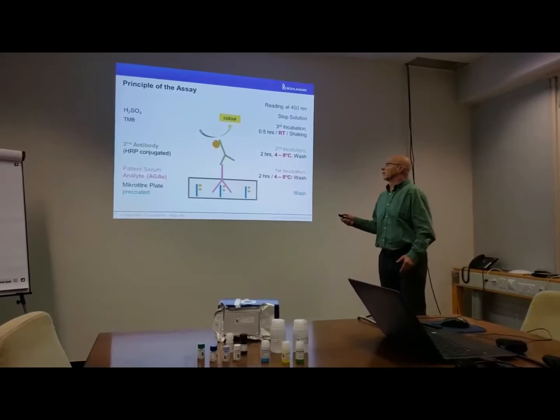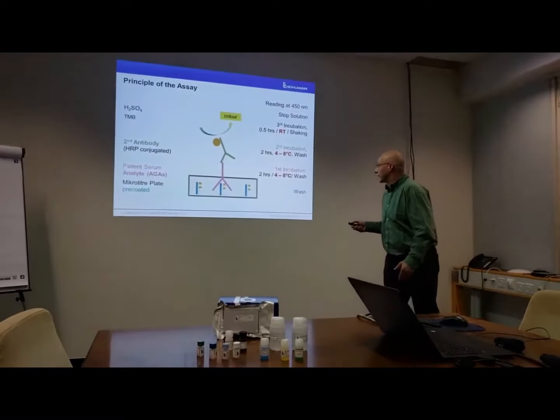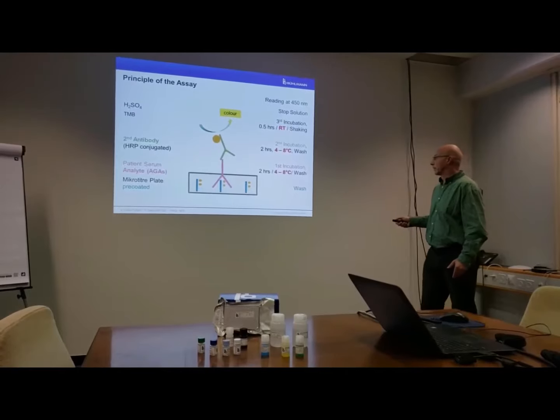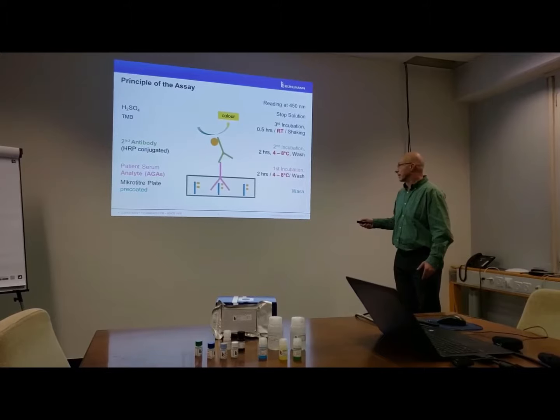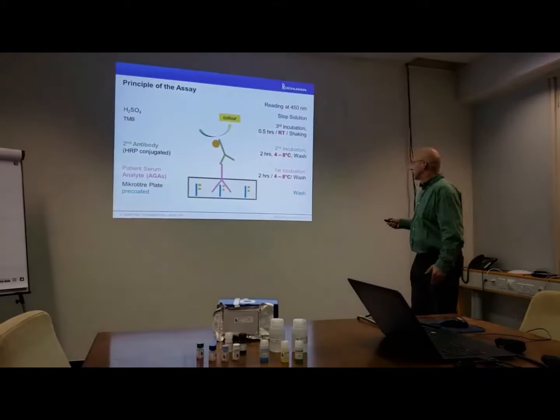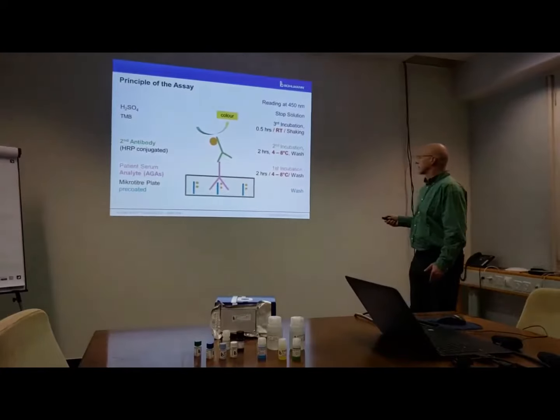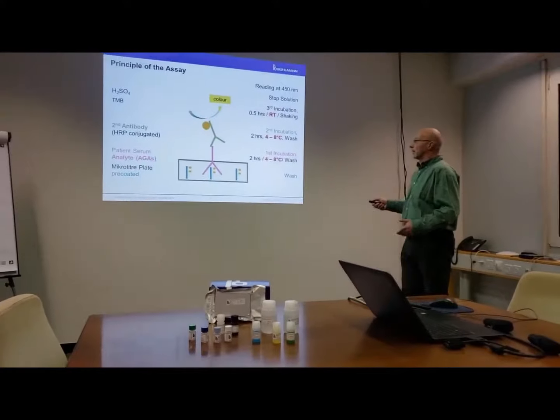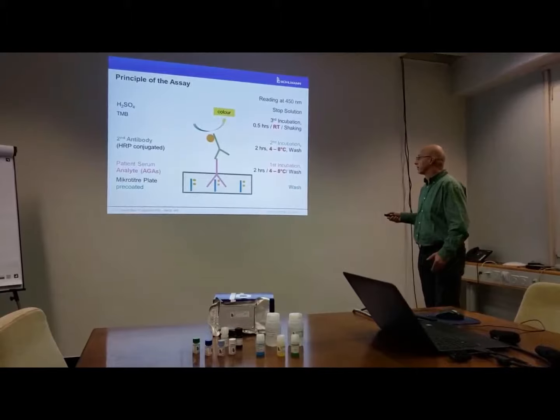What is the principle of the Bühlmann GanglioCombi Light assay? You see here a single well, which is coated with the ganglioside here in the blue color, and here the sialic acids. First of all, when the plate is unpacked, the plate has to be washed with cold wash buffer. In a second step, there is a first incubation where the patient serum is added to each of the wells.